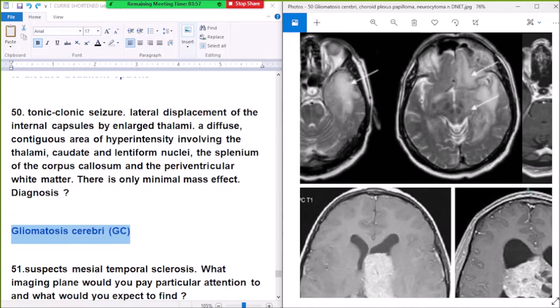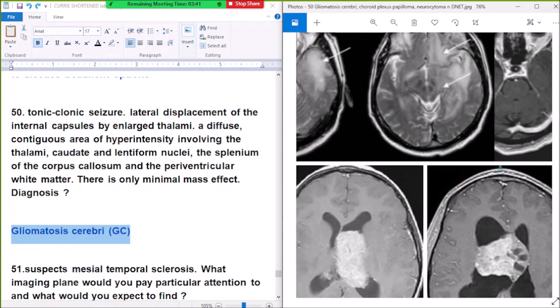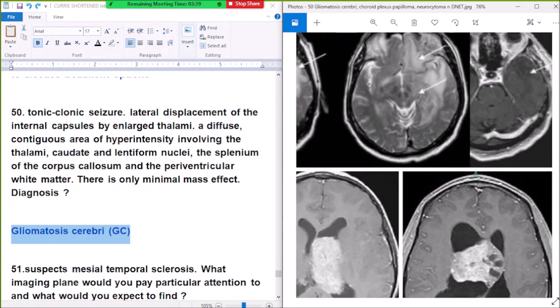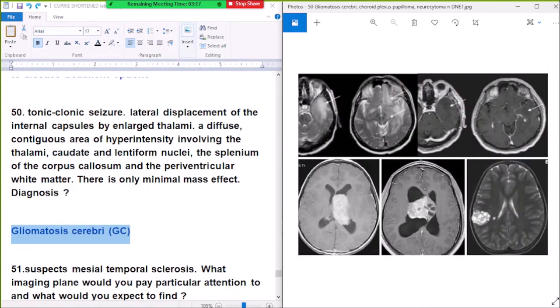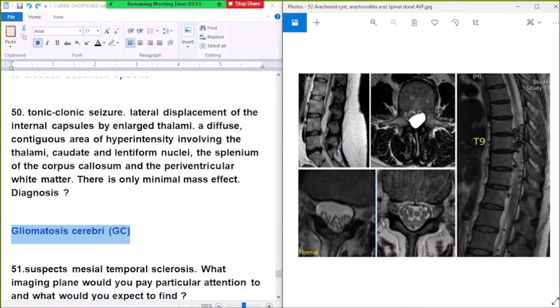There is hyperintensity involving the thalami, the splenium of the corpus callosum, the caudate nucleus, lentiform nucleus, and periatrial white matter. If you see this pattern, the diagnosis is gliomatosis cerebri — high signal seen in the thalami, caudate, lentiform nucleus, splenium of the corpus callosum, and periatrial white matter. Question number 51.